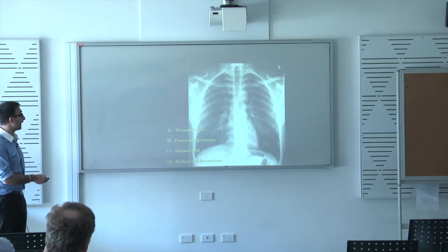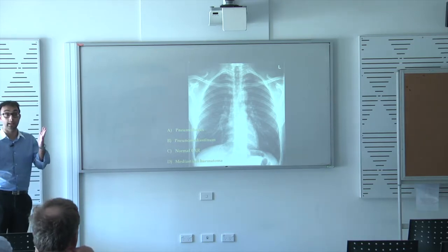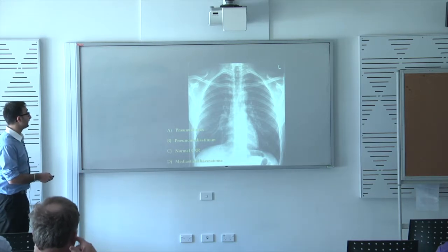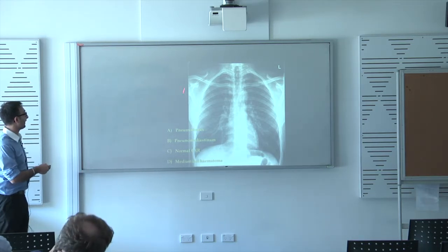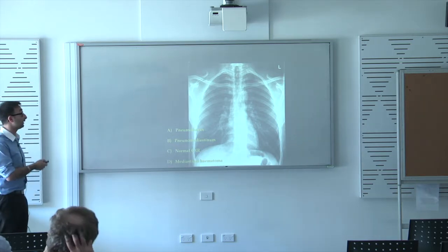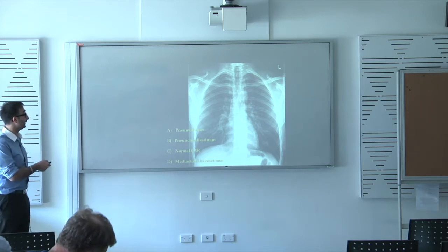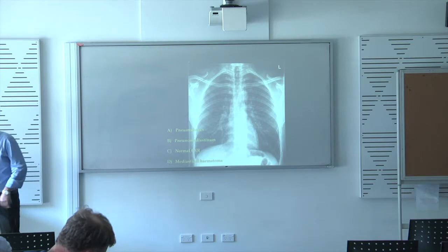A pneumopericardium won't traditionally extend up because it's at the root of the vessels, and the pericardium doesn't allow it. So this is a pneumomediastinum. Another thing is I've got a bit of gas on the right side here, just a bit of subcutaneous gas, which you can see in a pneumothorax, but you can also see it in a pneumomediastinum. And often you can see lucency tracking up the neck. So that's another good thing to look for.